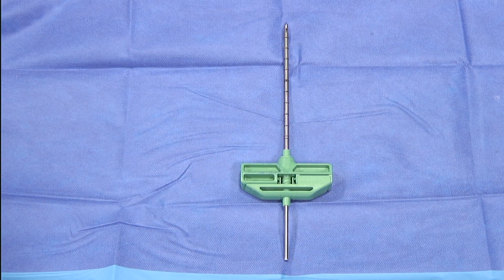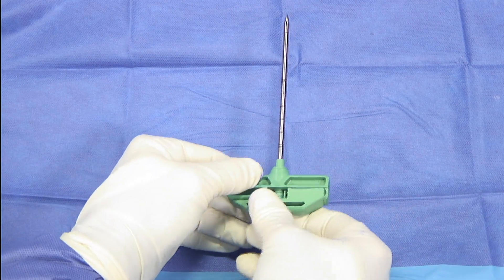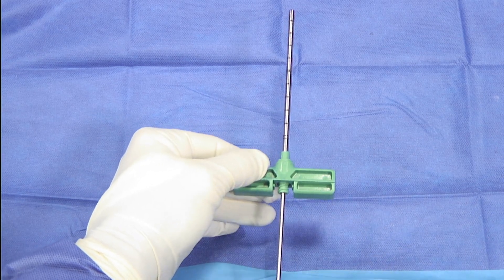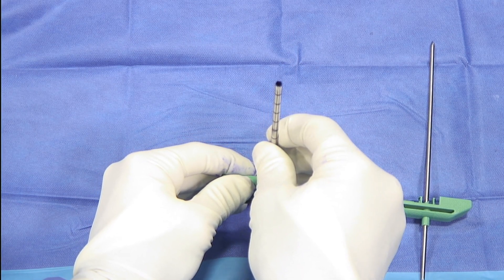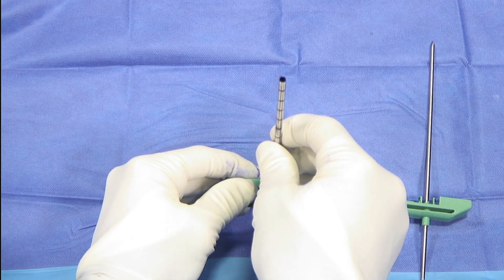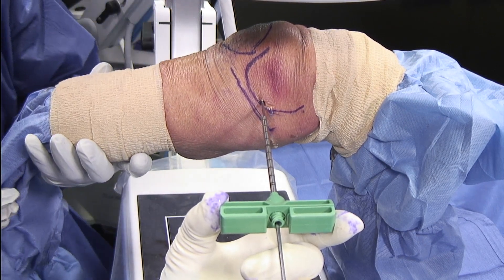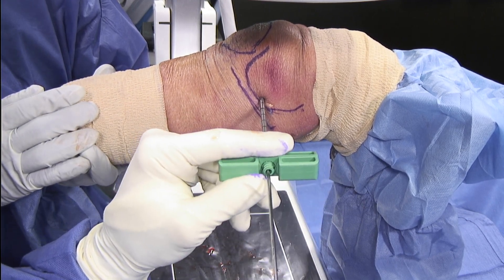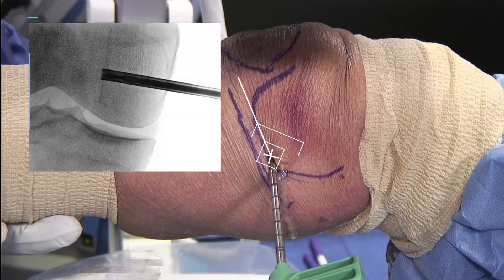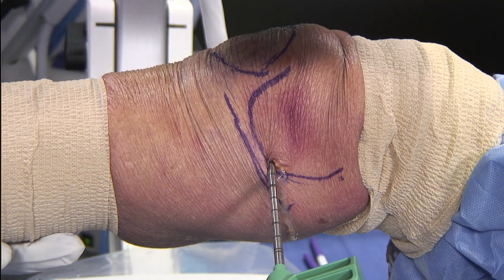The bone marrow concentrate will then be delivered through an open-ended delivery cannula. The delivery cannula has an inner stylus trocar that is removed. The inner diameter allows us to pass this over the 2.4 guide pin that was previously drilled during the core decompression. The open-ended delivery needle is then passed over our 2.4 guide pin into our previously created core decompression site. Image intensification is then performed to confirm location within our core decompression.